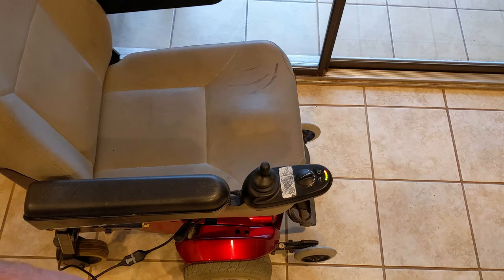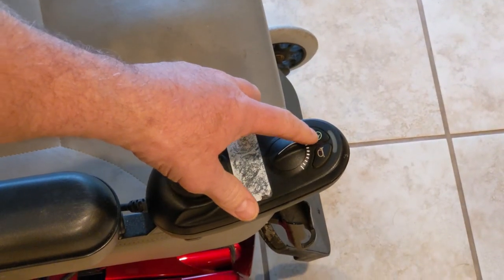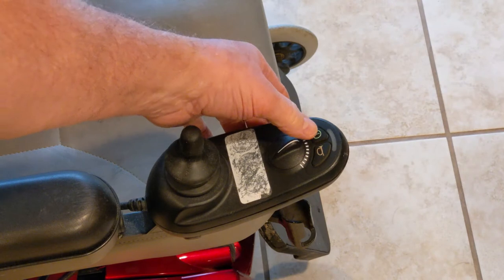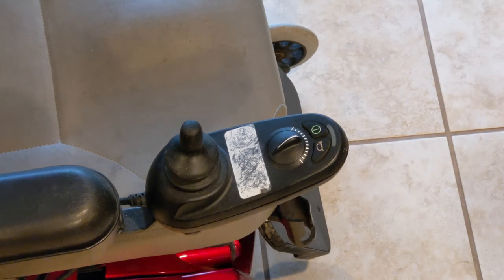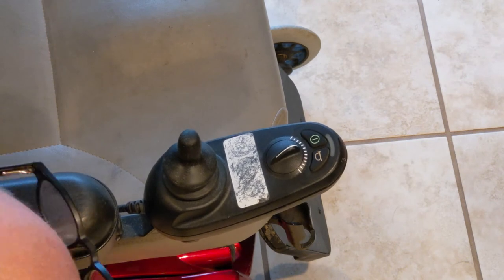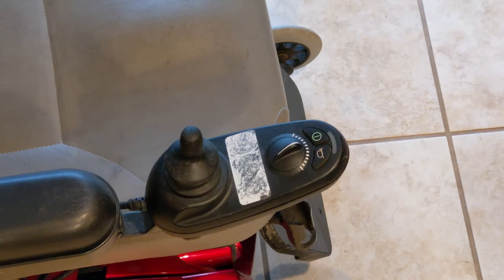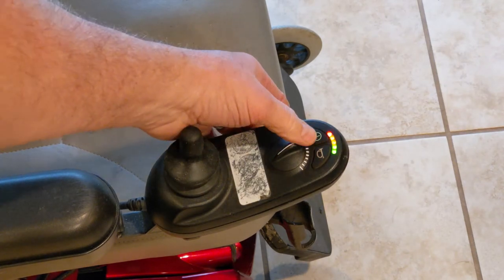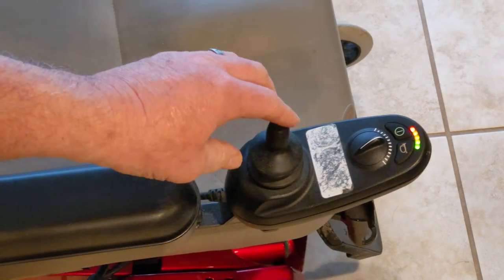Yeah, very quick response there — that's what the issue was. It's blinking because I don't have the gears engaged; I've got it set so it can be rolled around. But if I flip the levers up here, now it's ready to go.